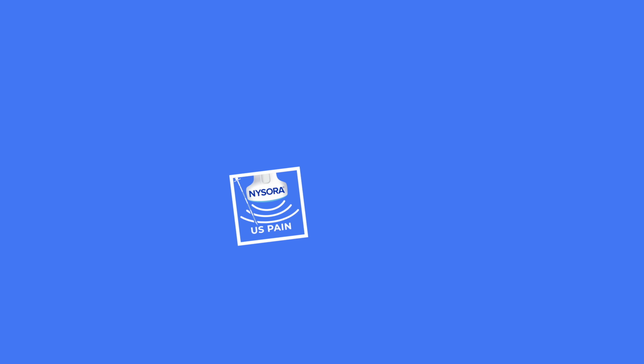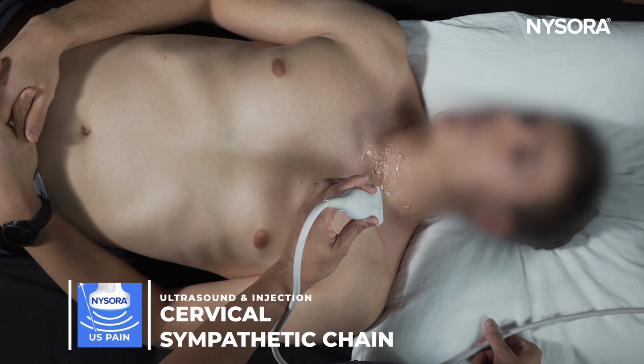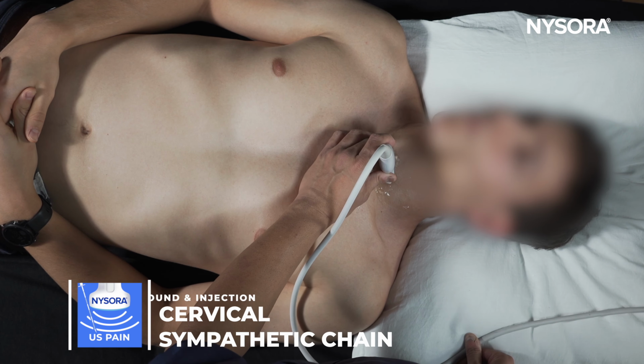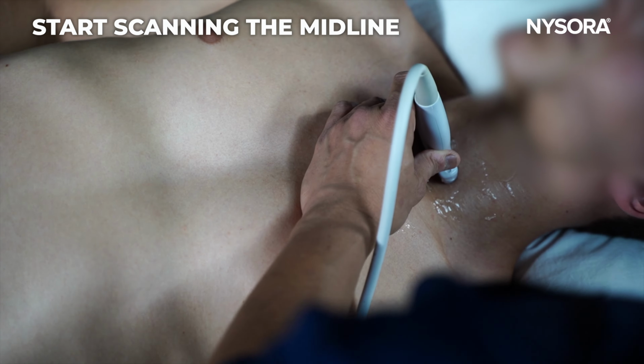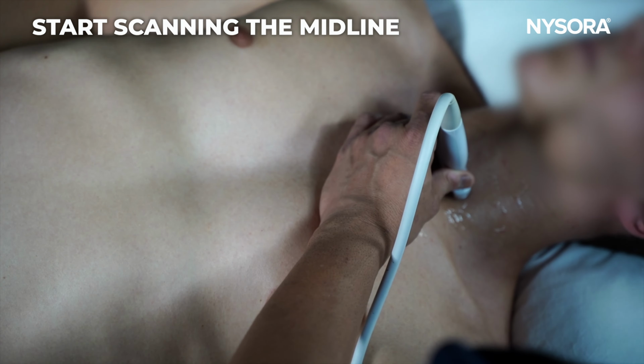Thank you. I'm going to show you how to do an ultrasound-guided middle cervical sympathetic chain block. To perform this block, you will start to scan the patient from the midline, and I always recommend scanning the midline because it will allow you to look for the familiar structures.